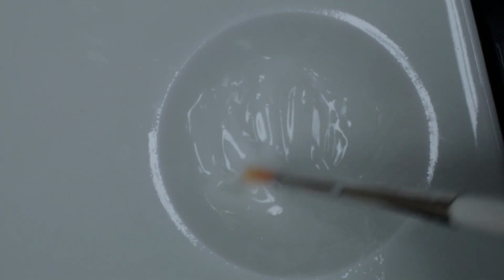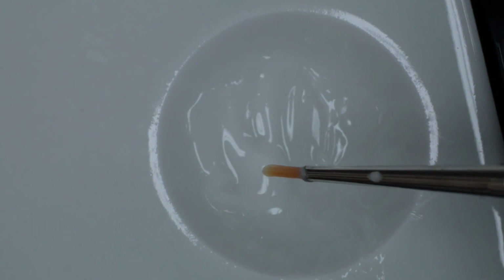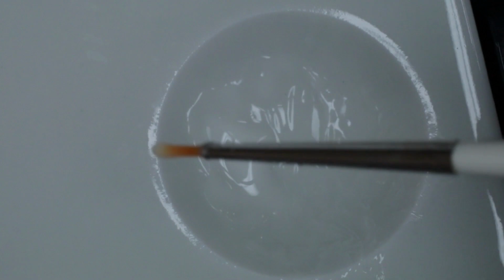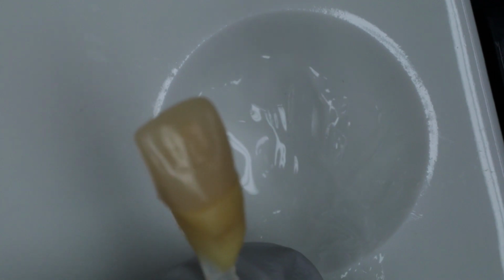But I don't want it super thick either, where when you apply it on, you're going to see that the material is actually leaving brush strokes in the glaze that you're applying. So if it's going on kind of thick, we may have to dilute it a little bit, but this looks pretty good. It's also handy to have some alcohol wipes, like a 2x2 soaked in alcohol nearby, just rubbing alcohol that you can clean your brushes with if you need to. All right, so let's go ahead and put some glaze on this baby.